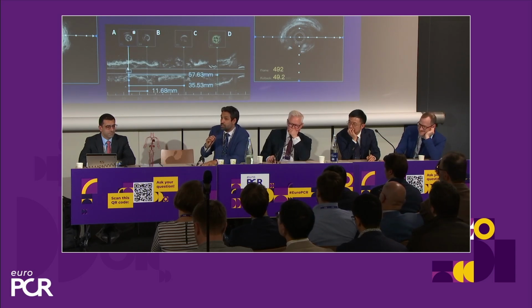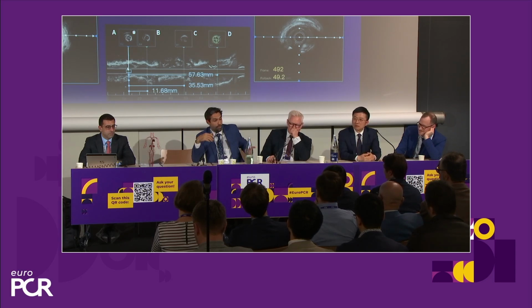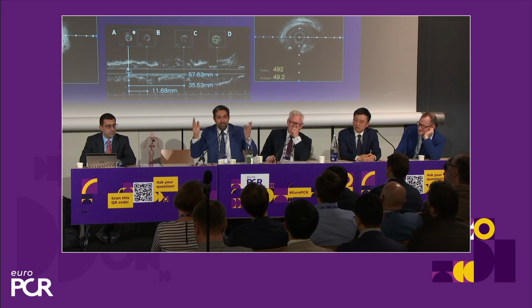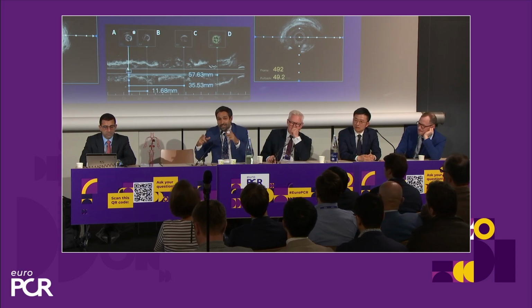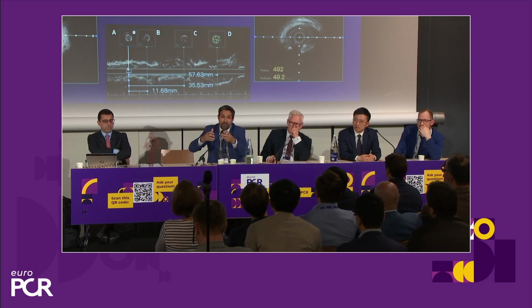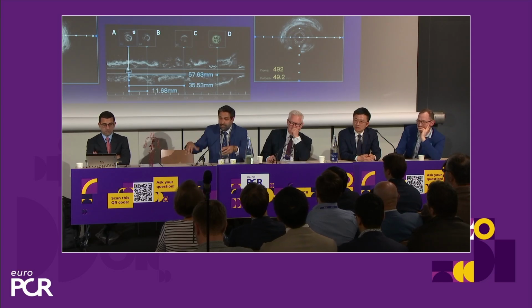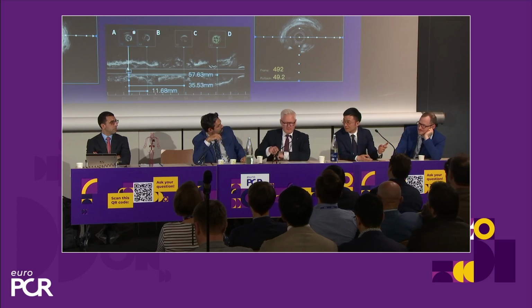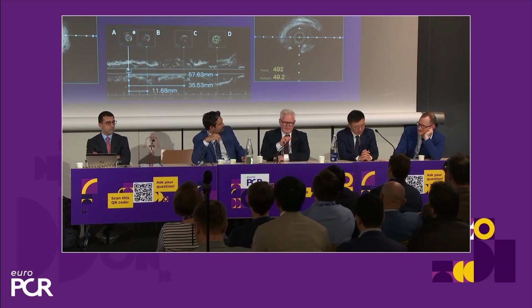Now, this is a debate that we can discuss, I think, for many hours. What is the best strategy? Of course, you have to cover the big pressure loss. That's obvious. The next question is, where do we land? And if you look at the landing zones that Jacek and Jin have produced, it looks like the only healthy landing zone that I can see from here is very, very distal. So now the whole discussion about short stent, DCB, only DCB, or full metal jacket LAD, that's a discussion I think you had in the cath lab when you saw this information. Jacek, I don't know what was in your mind when you saw the IVUS and the physiology together.